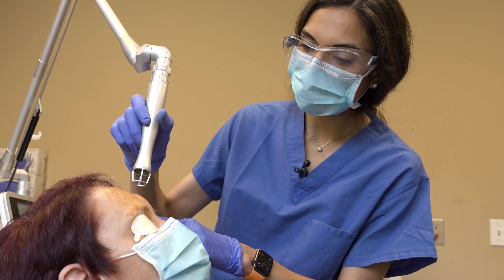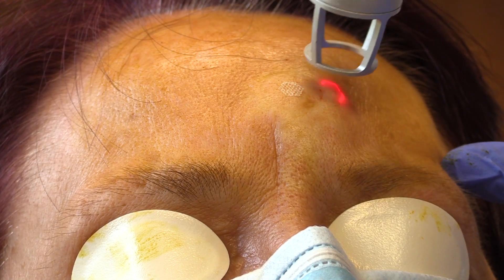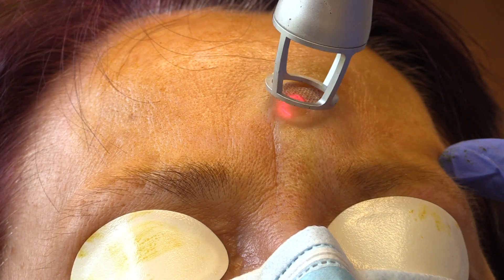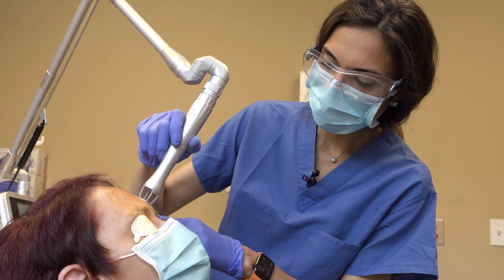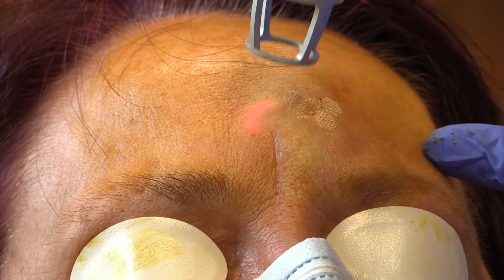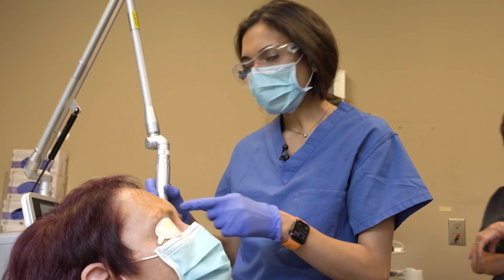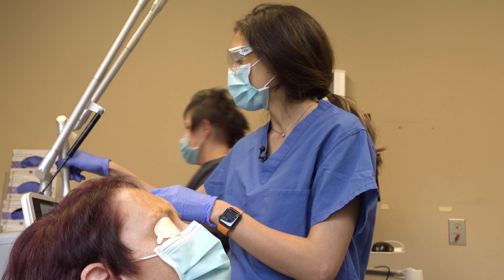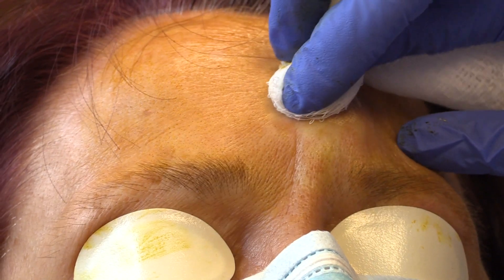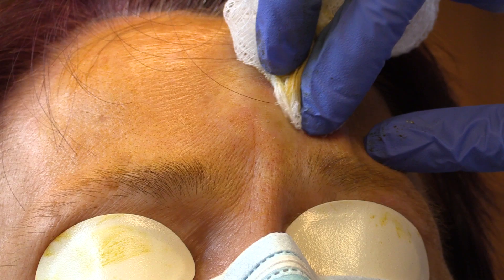The laser is like a stamping tool, and essentially it stamps along the entire area of the scar. Now one pass has been done. We put the laser on standby and then we wipe off the char that forms on the surface. You can see that some of that scar tissue is already wiping away.